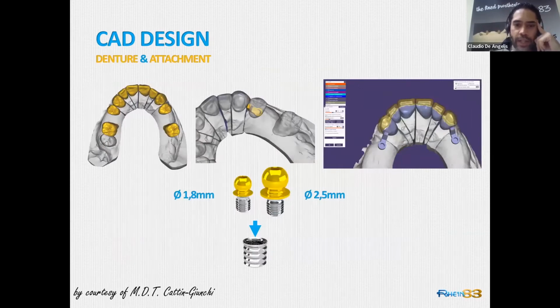What they did, they just design the proper teeth setup. Again, always remember that a patient needs to chew, needs to smile. The patient needs a proper, well-made denture. A patient does not need an attachment, okay?